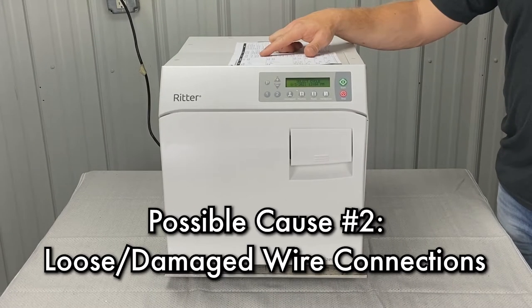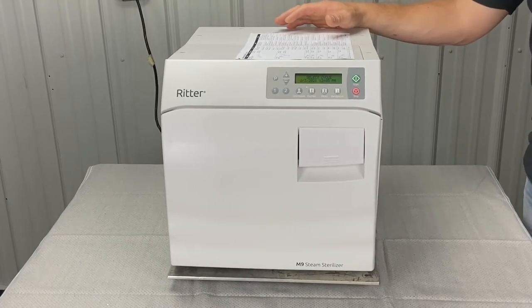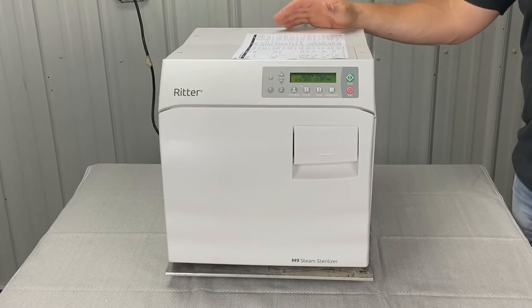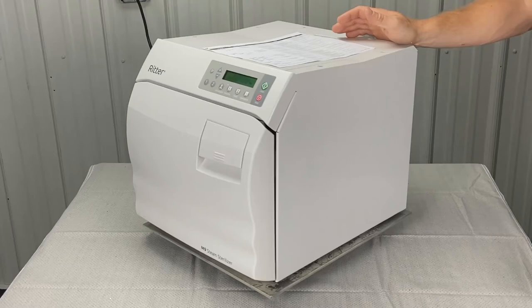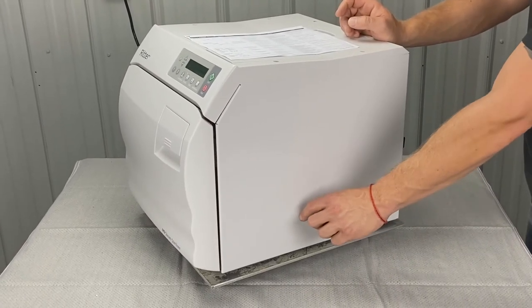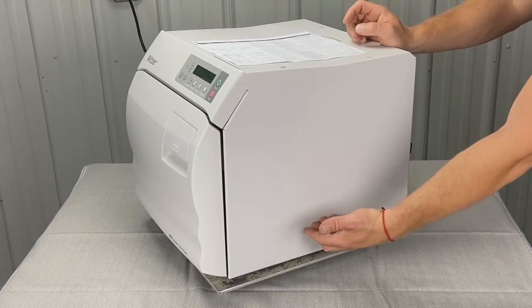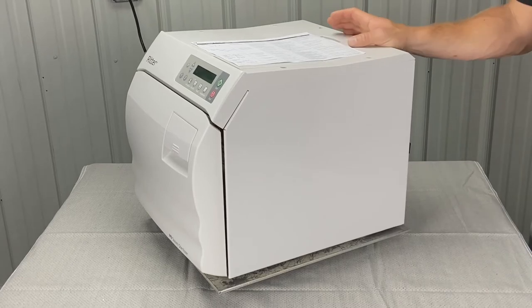Also check for loose or damaged wire connections. Check AC terminals and connections on J5 on the PC board. With the PC board revealed, you'll see J5 is a white pin connector that could have burnt or browning connections. You're also going to want to make sure it's pushed all the way in.